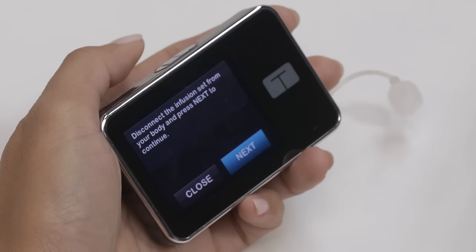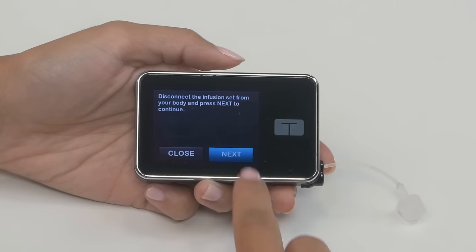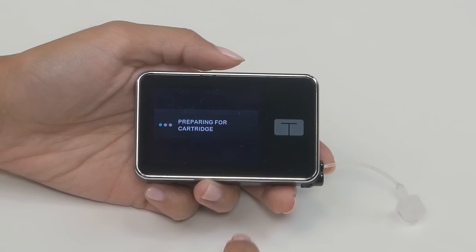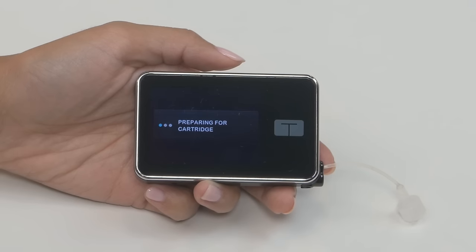Next you'll be prompted to disconnect your infusion set from your body. Tap next to continue. You should see the preparing for cartridge screen.